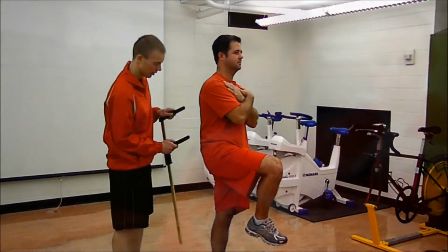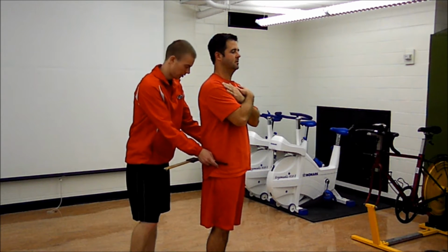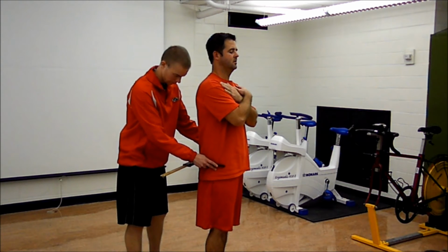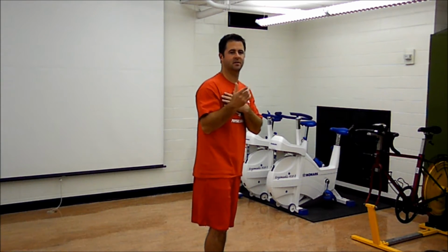The average of the recorded values should then be used. When recording the number or value on the caliper, remember to read it after you have applied firm pressure with the fat, muscle, and skin compressed, and make note of the measurement prior to releasing the pressure.